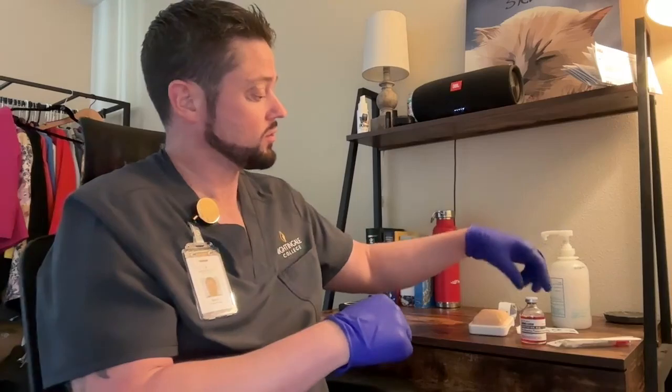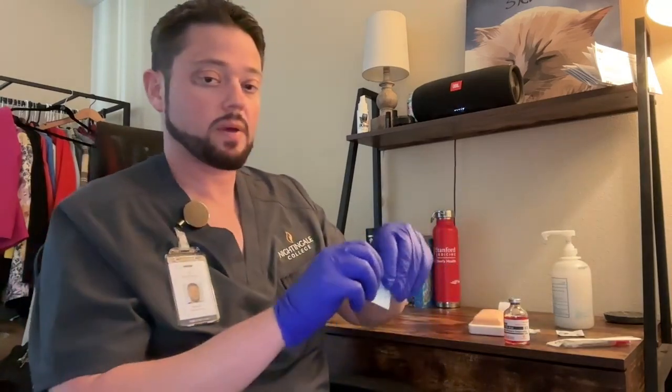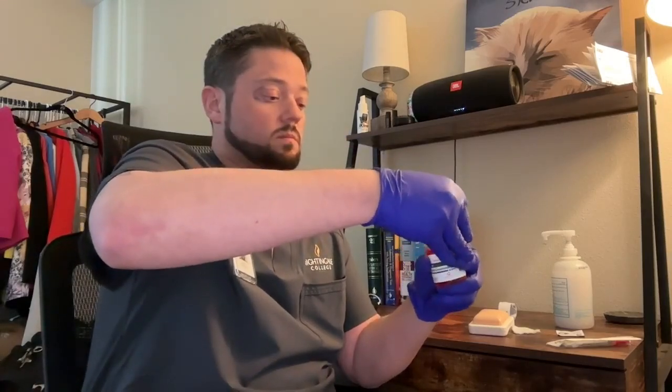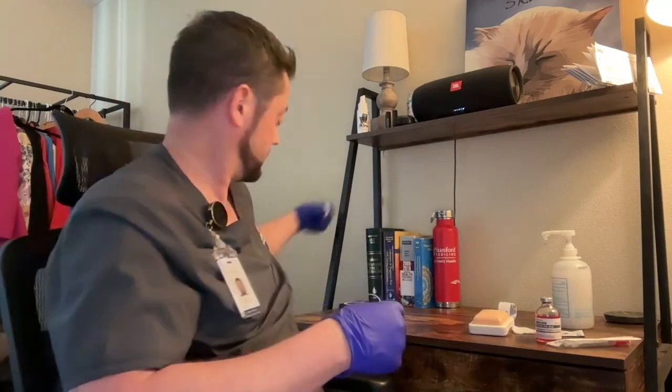And then we're going to draw up our medication. To do this, we want to remove the cap from our vial. We're going to dispose of the cap in the trash. I want to take an alcohol pad and thoroughly clean the top of my vial by scrubbing the top of the vial. I'm going to set that aside to dry.